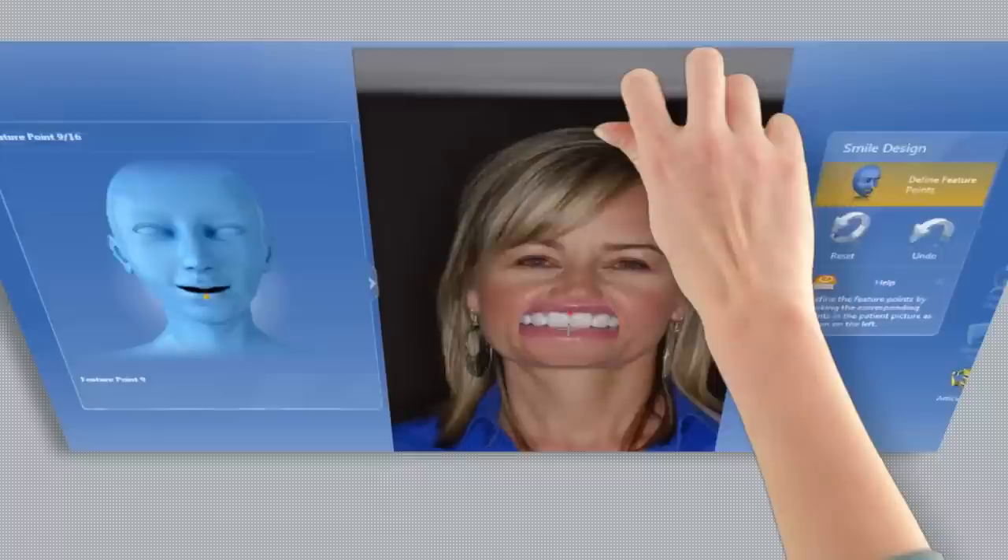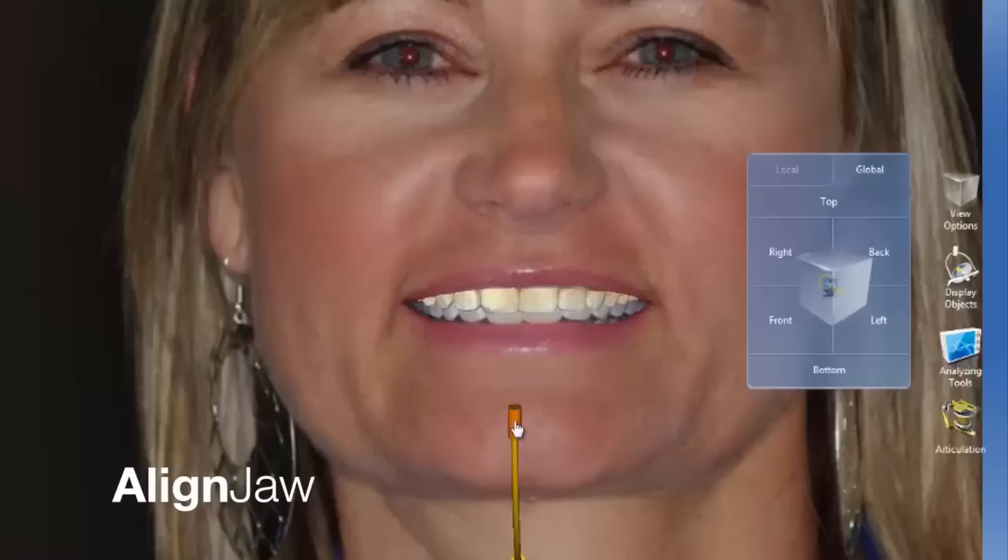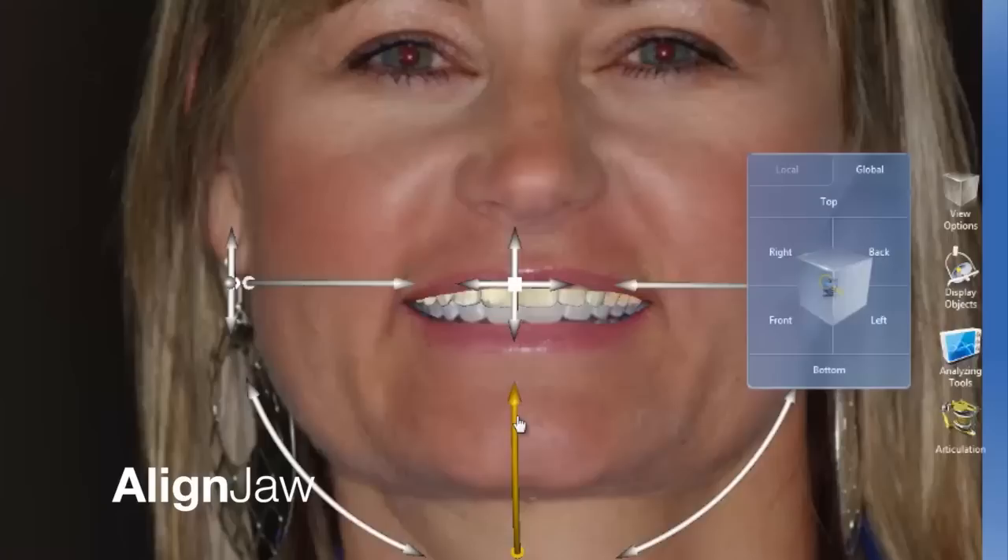Her digital teeth are simply done with a scan of her upper and lower teeth and then oriented. We take that digital model and put it right into her two-dimensional picture. There's a rotation and positioning tool that allows us to rotate that model and guide it right into place so that it fits exactly into her face as it does in real life.